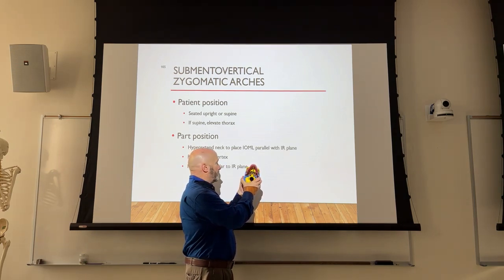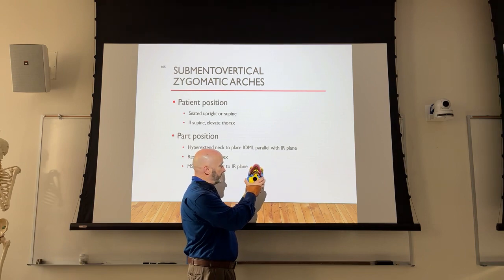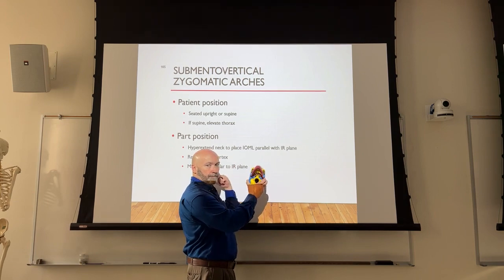No. It doesn't come into play until you tilt it, right? So it's saying rotate towards the side of being examined, and then it says rotate the top of the head away from the side being examined. All right, so top of the head is here, so top of the head is coming this way. Chin's going that way, top of the head's coming this way.